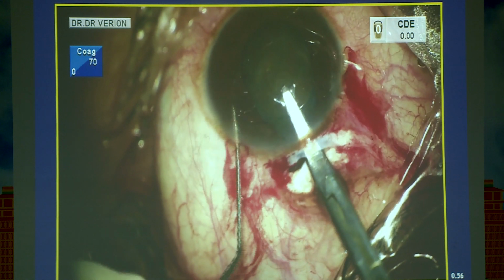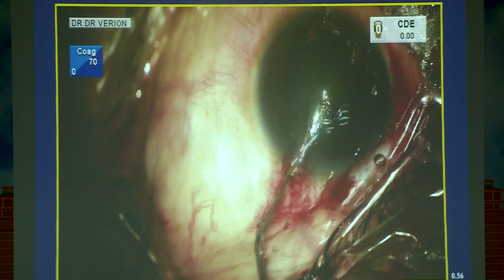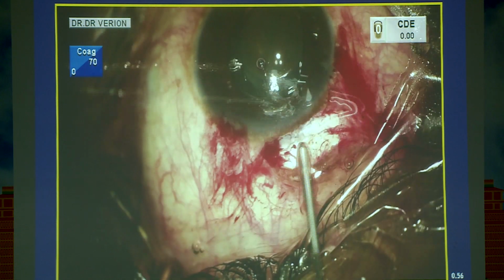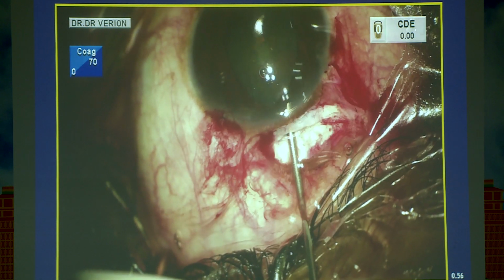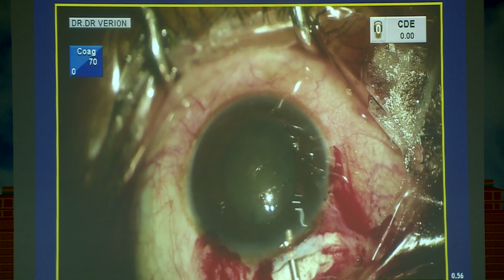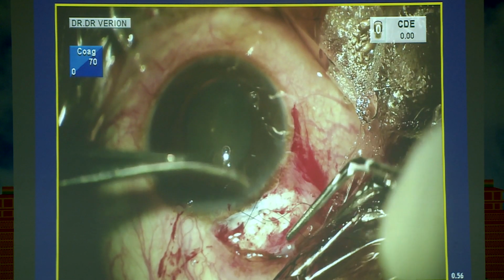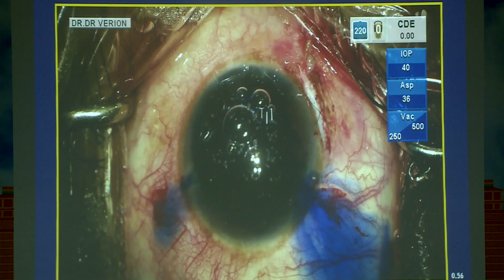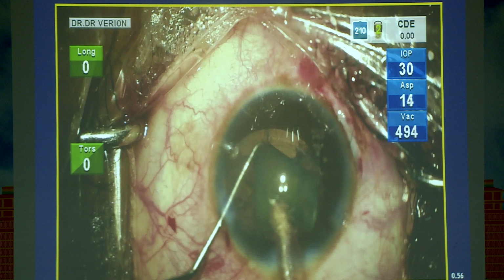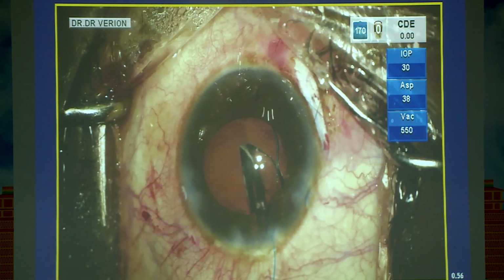Essentially what you do in this is to create a 5 or a 6 millimeter sclerocorneal incision, because that's the PMMA optic size, and then you disenclavate the haptics as you saw in this particular case, and then you just inject a little bit of viscoelastic. Often the endothelial cell count is already compromised in these cases, so your surgery has to be extremely gentle. And then once you have done that, it's a good idea to suture up this incision and then switch over to your temporal clear corneal incision and do the phacoemulsification the manner that you are accustomed to.